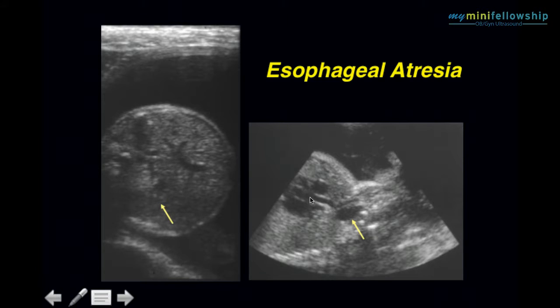Here's the heart. The blood vessel coming out of the dead center is the aorta. It's going up toward the arch. Here's the trachea, and sitting behind the trachea is where the esophagus lives, and we can see this dilated esophageal pouch. Now, I don't have the patience to wait around, hoping that I'll see the fetus try to imbibe some liquid and that will dilate the esophageal pouch.